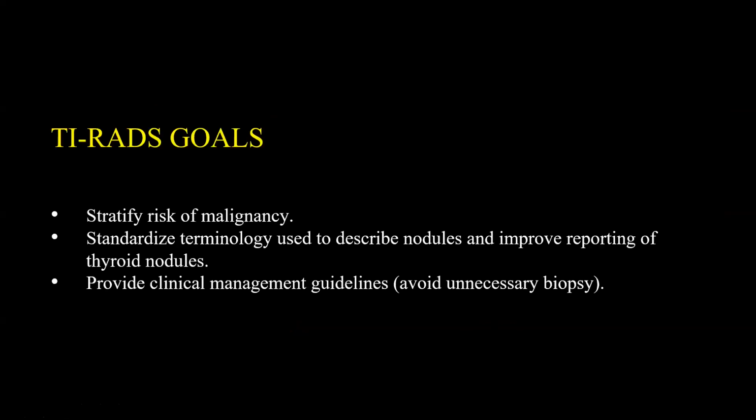So the whole reason why radiologists came up with TI-RADS is there's been so many different ways of analyzing thyroid nodules from different organizations that it's been very hard for there to be any sense of consistency. Number 1 for radiologists, but number 2 for the referring physicians to know what to do with our descriptions. And many times in the past 10, 15 years ago, the endocrinologist wouldn't even know what to do when we spoke about a nodule. So this is really helpful for us.